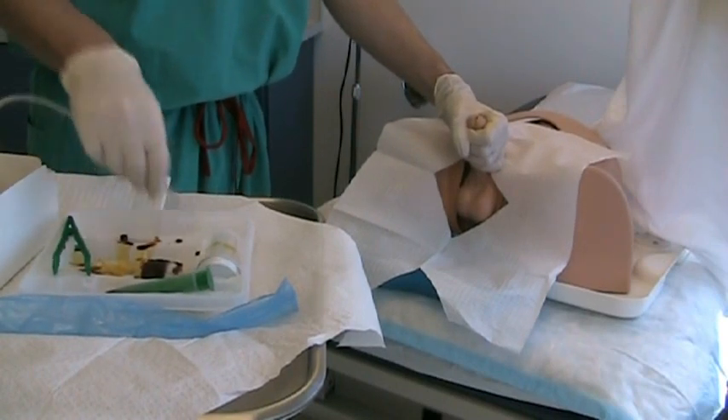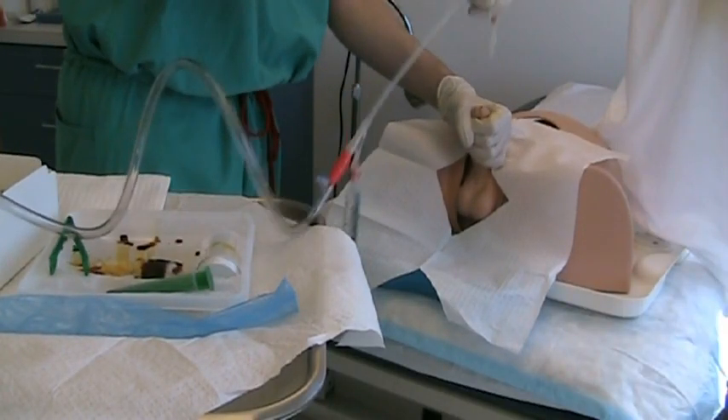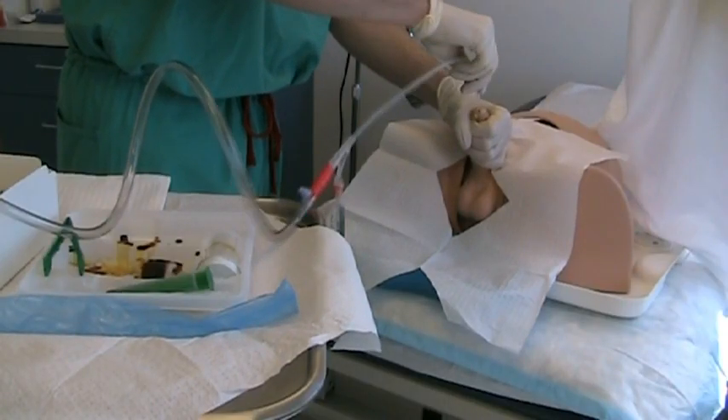Using only the right hand, the catheter is inserted into the urethra. The entire catheter should be inserted before blowing up the balloon, even if urine is seen before that point.